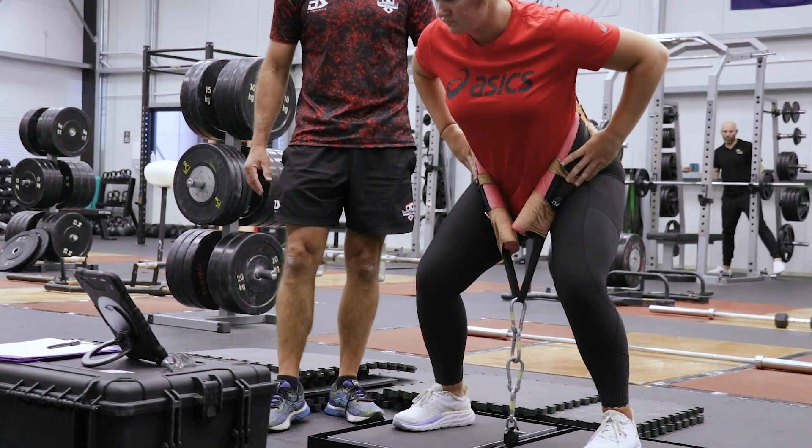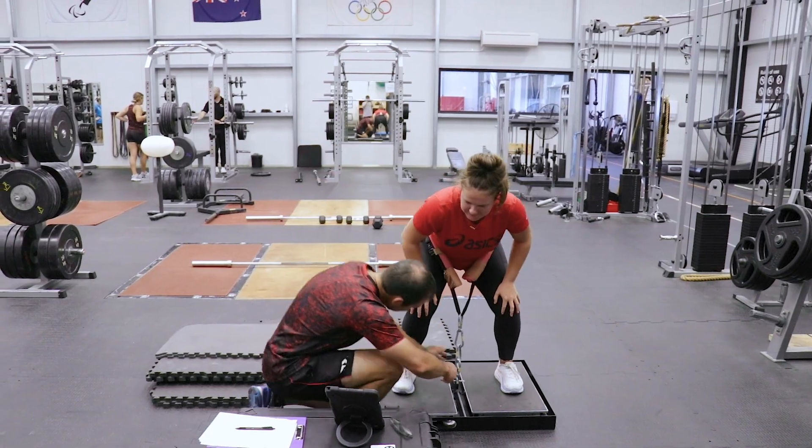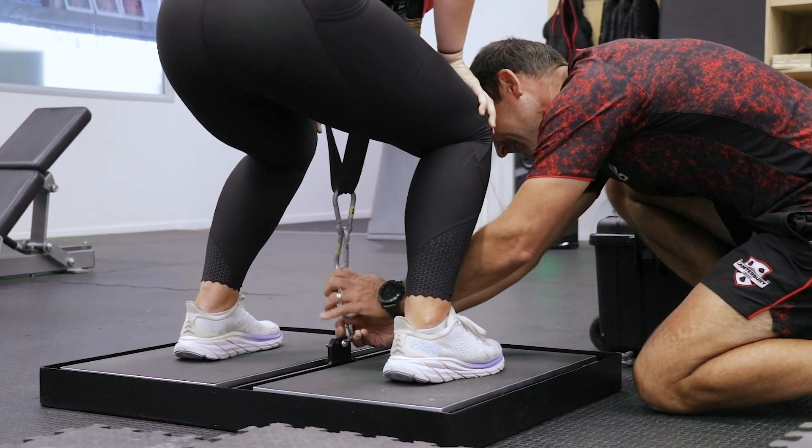It's really useful for someone coming back from surgery who is favouring their non-injured leg compared to their injured leg, because they often try and hide things. It gives us confidence to say, no, actually this person has loaded their injured leg.